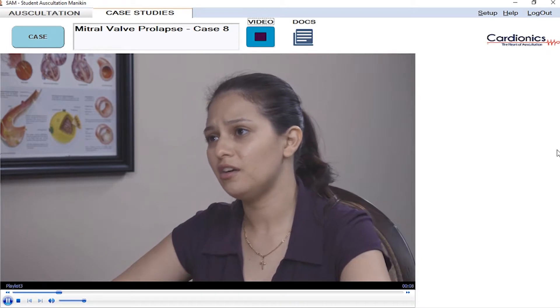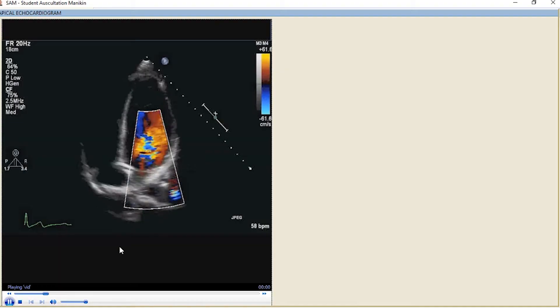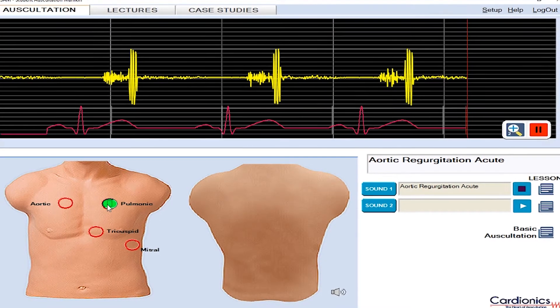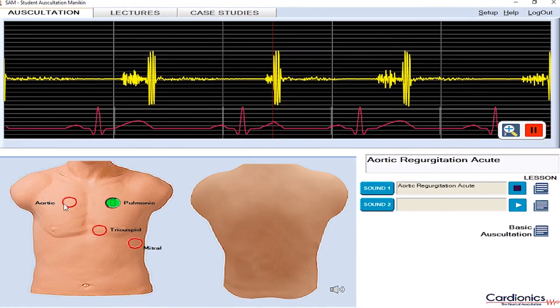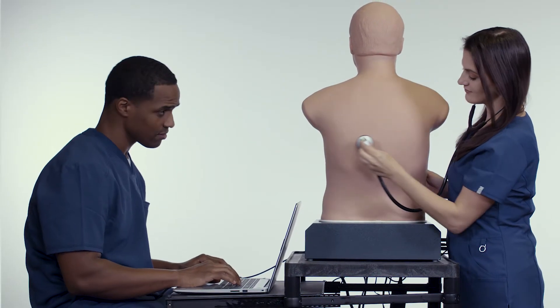With SAM 3G, we've made major software upgrades to engage students in auscultation education more than ever. Now, SAM 3G comes with 24 case videos, a library of 24 Real Sounds, 12 echocardiogram videos, and EKG waveforms for every sound. With a user-friendly interface, instructors and students will be able to operate and program SAM in minutes. SAM 3G's software offers one of the largest libraries of real and simulated sounds in the industry.